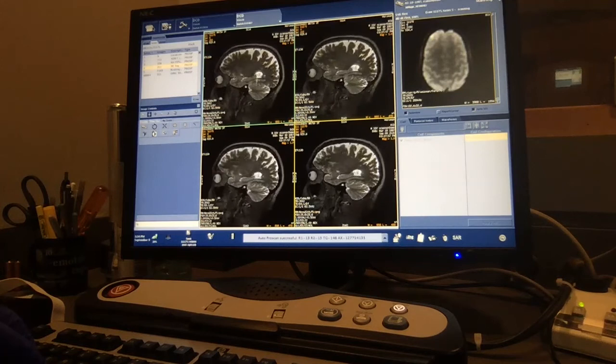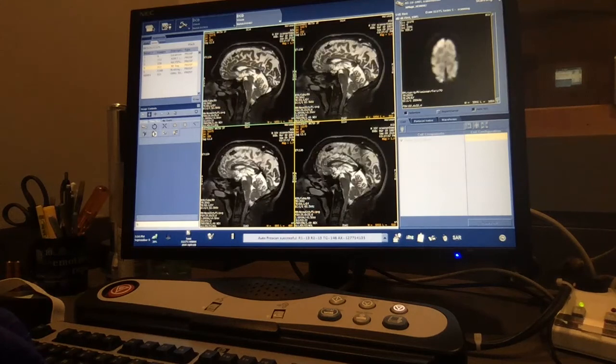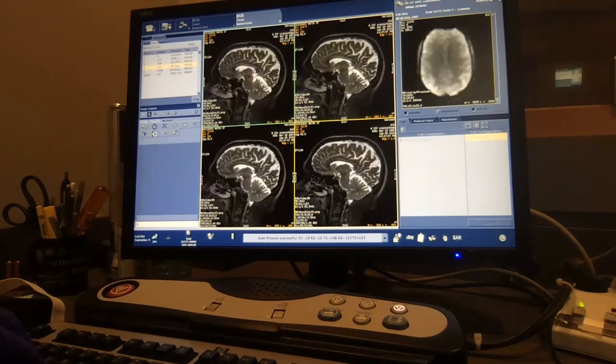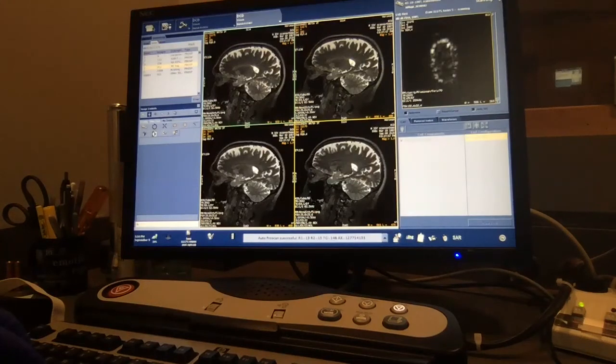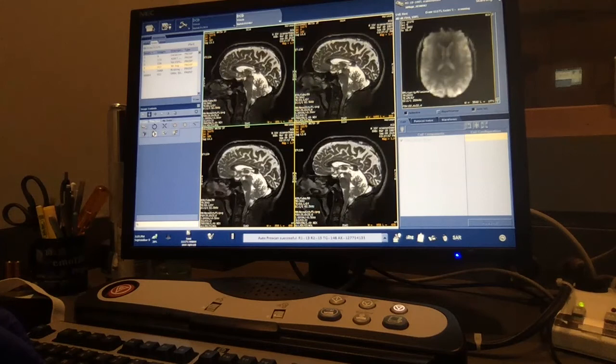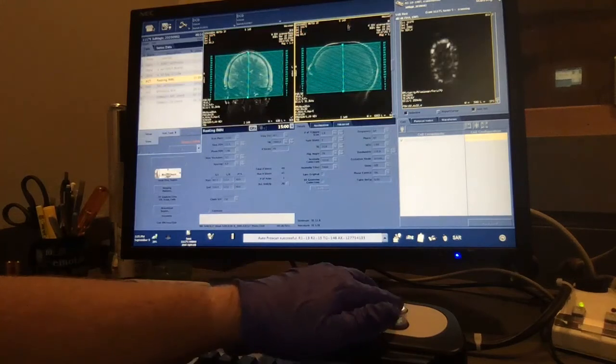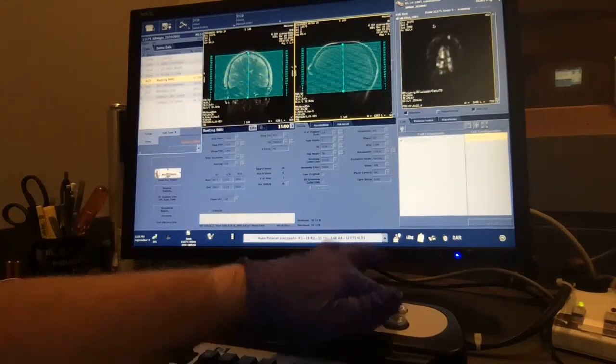Again, very nice detailed image. It shows great contrast between gray matter, white matter, and CSF, and really nice detail in the microstructure. You can see the differences here in the cerebellum, and see those white matter branches branching out into the cerebellum. You can make out the brainstem really nicely. Here's the corpus callosum, very dark in this white matter tract. And again, you can make out this fine microstructure in the brain. So I'm going to go ahead and stop this resting state scan.